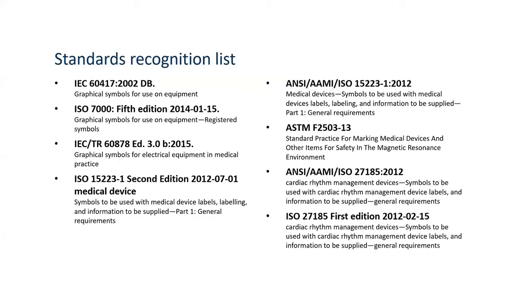There's also a number of related standards which point towards things like the use of graphical symbols, the enhancement of the controls, software user interfaces, workstations, mobile displays.